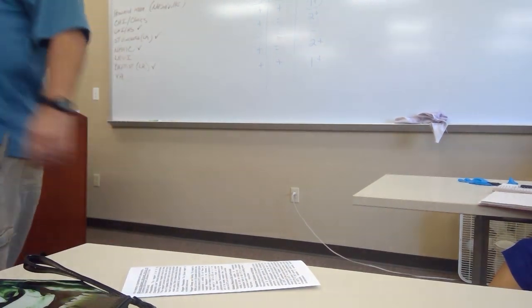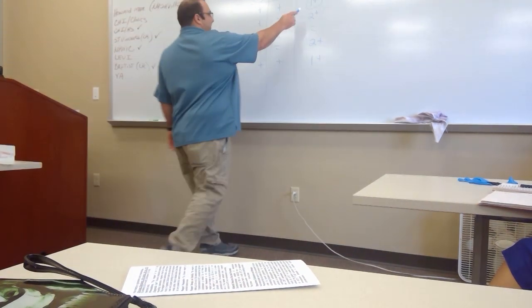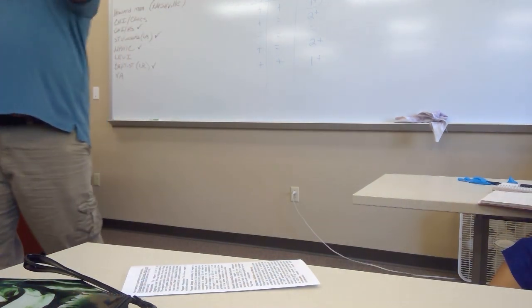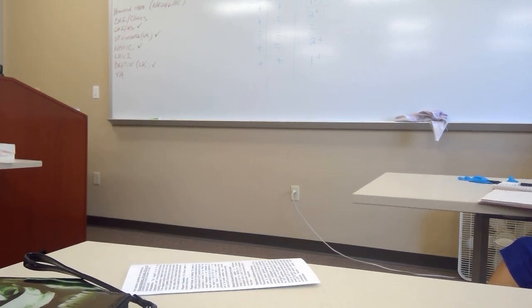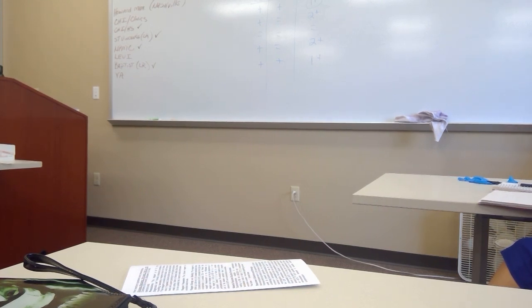I'm trying to wrap my head around the idea of dosage. Does that mean like amount of activity? Yeah. When they're inherited together, there's less activity. Like I said, think of it as Duffy A and Duffy B are, when they're sharing the red cell, Duffy B is taking up a lot of space that Duffy A can't use now. So it reacts weaker because there's not as many antigens. Whereas if Duffy B's not there, Duffy A gets to spread out and go wherever it wants to go. Or vice versa.